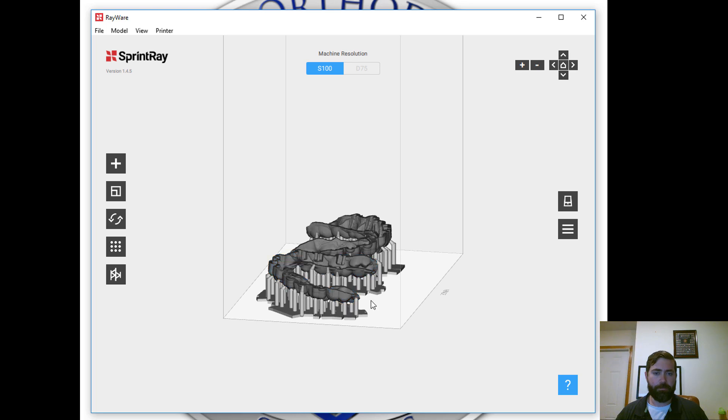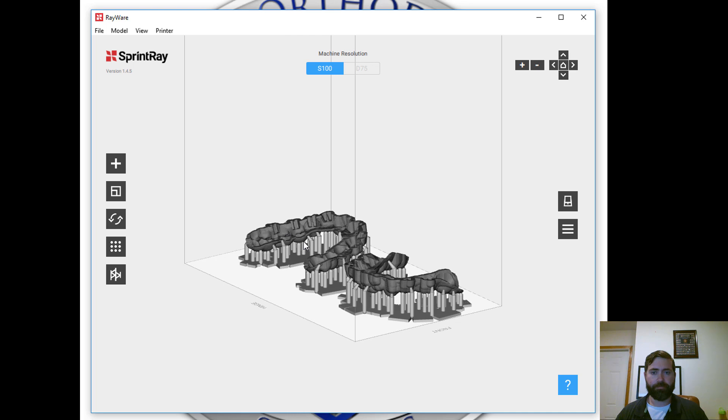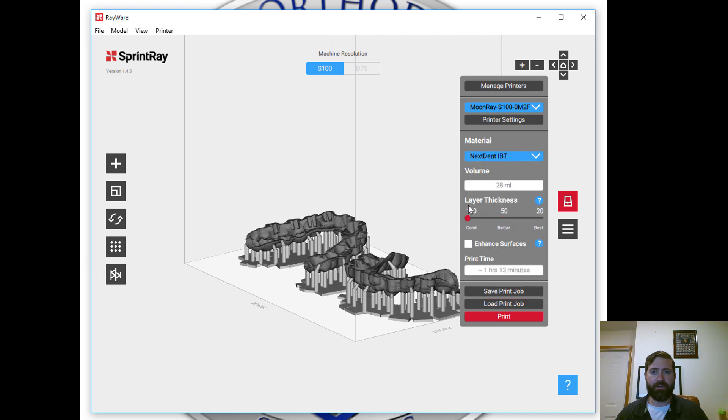So there we go — looks good. The material that we'll be using is the Nextdent IBT, and I want to hit 100, and then that's it, and we'll get to printing.